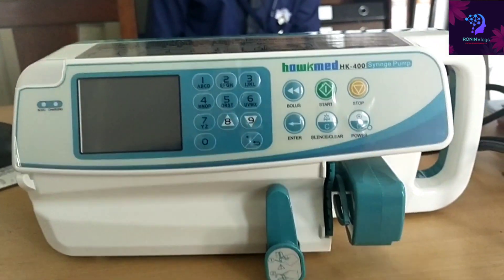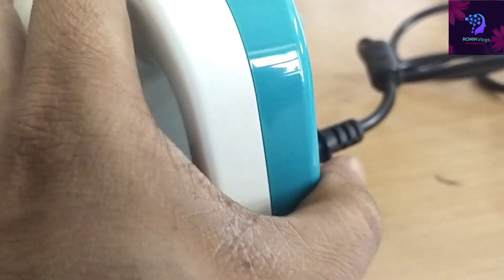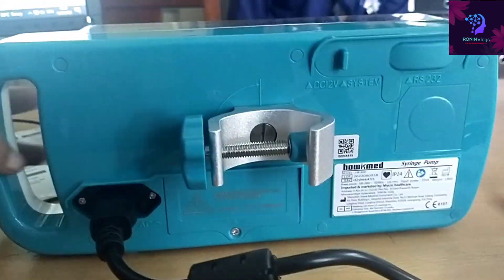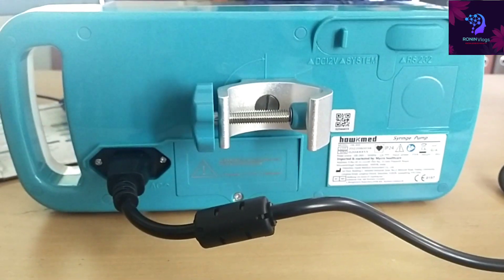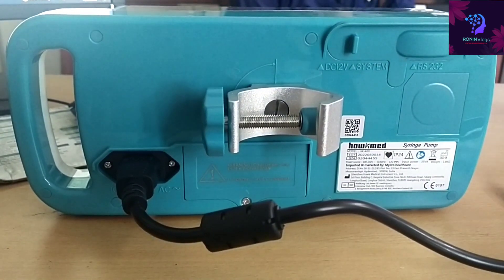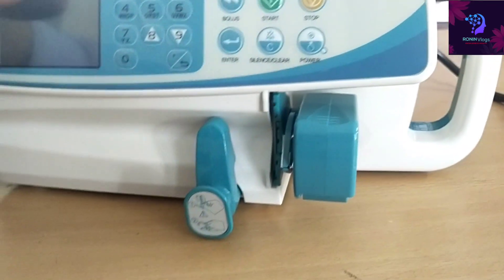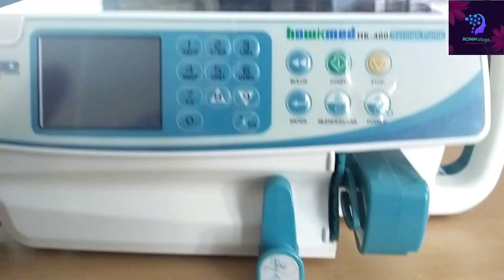This is the sensor lock — just press and we can move. This is the power cord, 230 volt direct power supply. On the back side, a clamp is available, which is used for fixing onto the IV stand. This is the front side display.